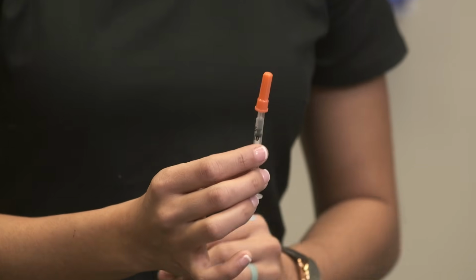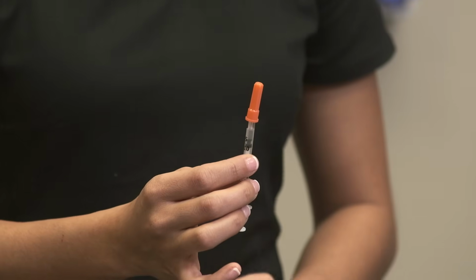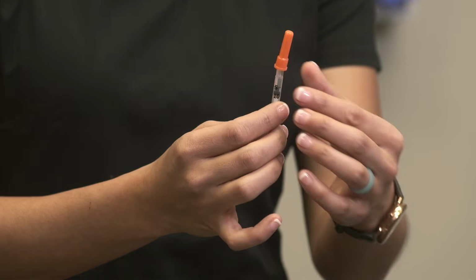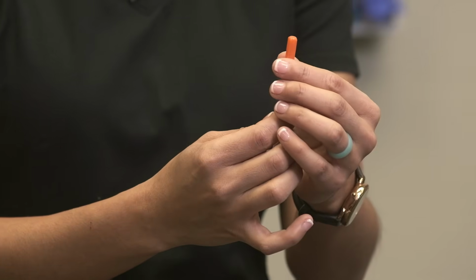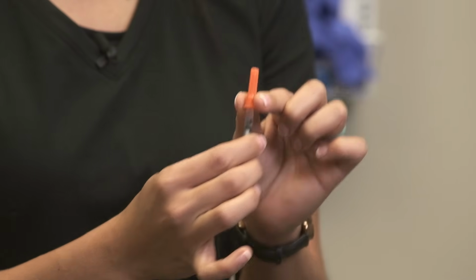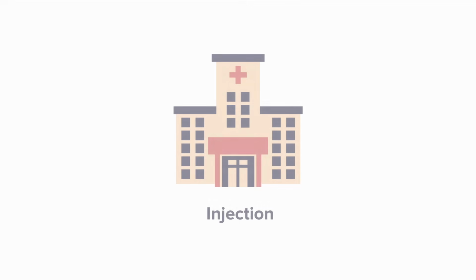And also, this is a very fragile needle, and you never know, this could also puncture the cap. So I recommend taking your hand on the sides of the cap, not on top, and pushing this down securely until you hear the click.